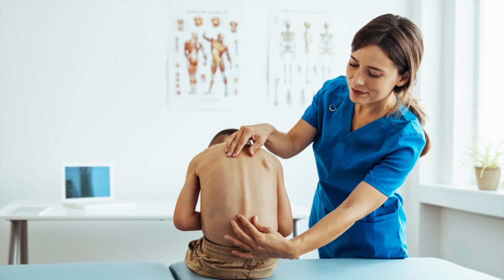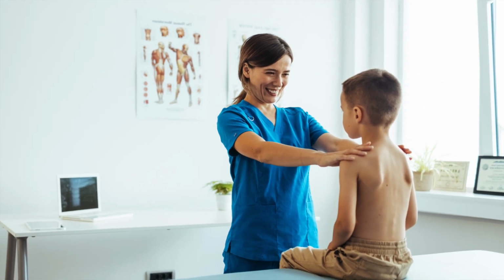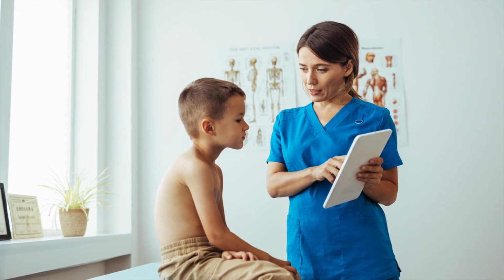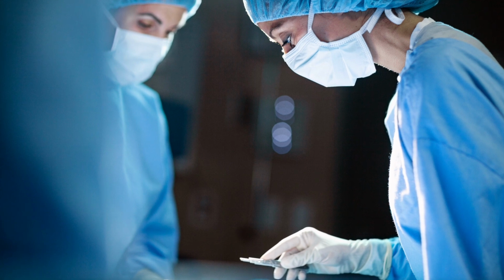An optimal patient position for spine surgery is vital for the surgery to be successful and to minimise complications during and after surgery. This is of particular importance when the surgeon is operating on children. Surgery to correct spinal deformity in children requires the patients to lie on their stomach. But when the patient has abnormalities in their body structure, such as a prominent rib cage or sternum, or other health conditions which make lying on their stomach unsafe, it's particularly difficult to position them safely and prevent injuries caused by prolonged pressure on the skin.